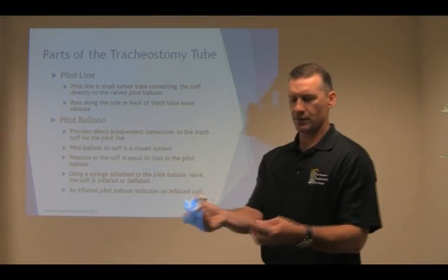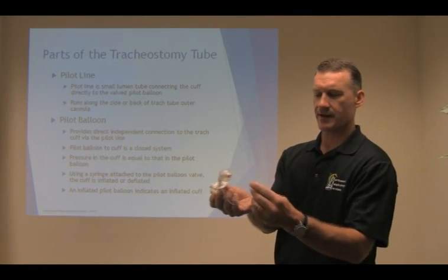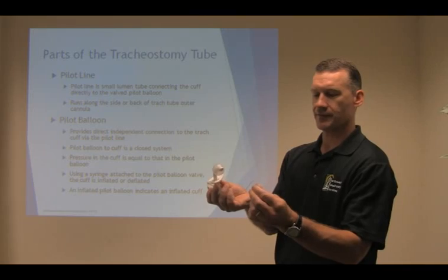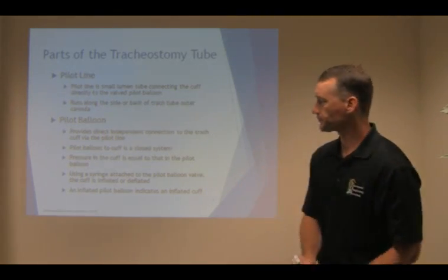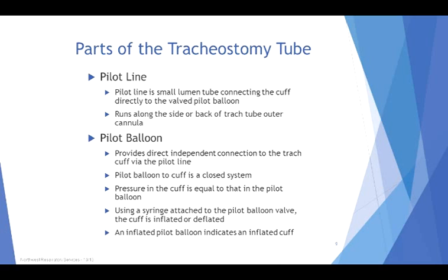This is our pilot balloon. This is the cuff. We get a direct reflection of the pressure within the cuff by squeezing on the pilot balloon. Using a syringe attached to the pilot balloon valve, the cuff is inflated or deflated. An inflated pilot balloon indicates an inflated cuff.